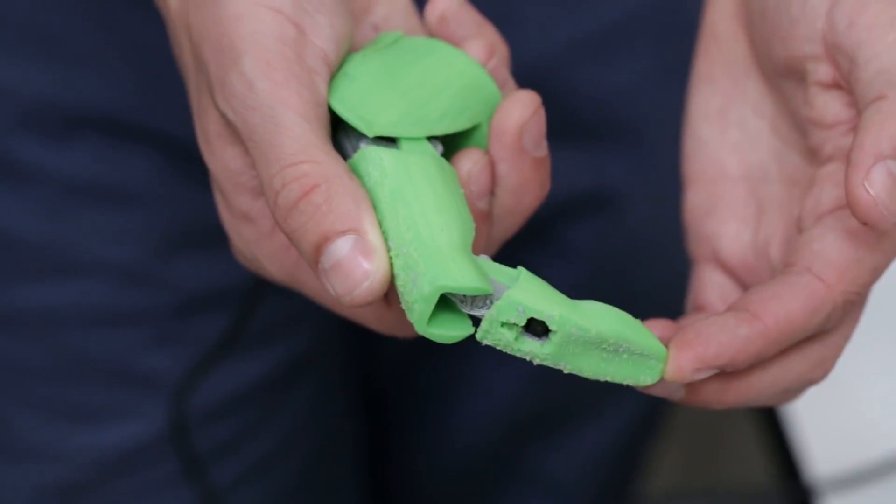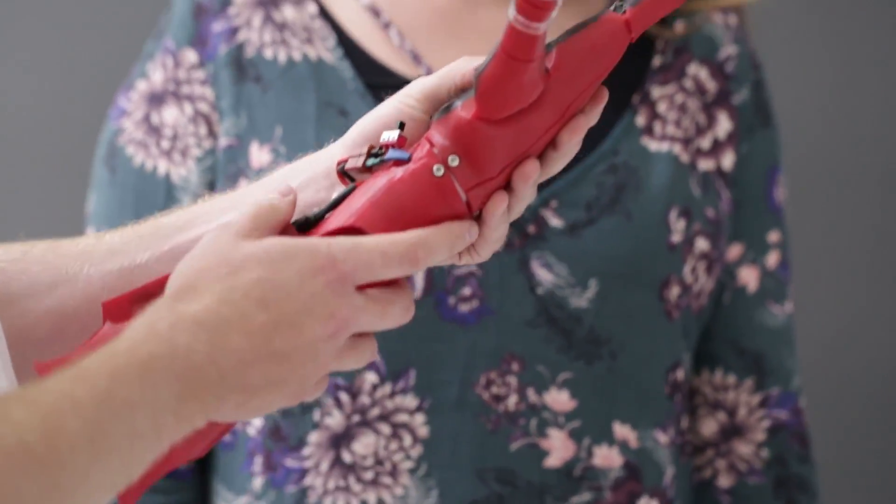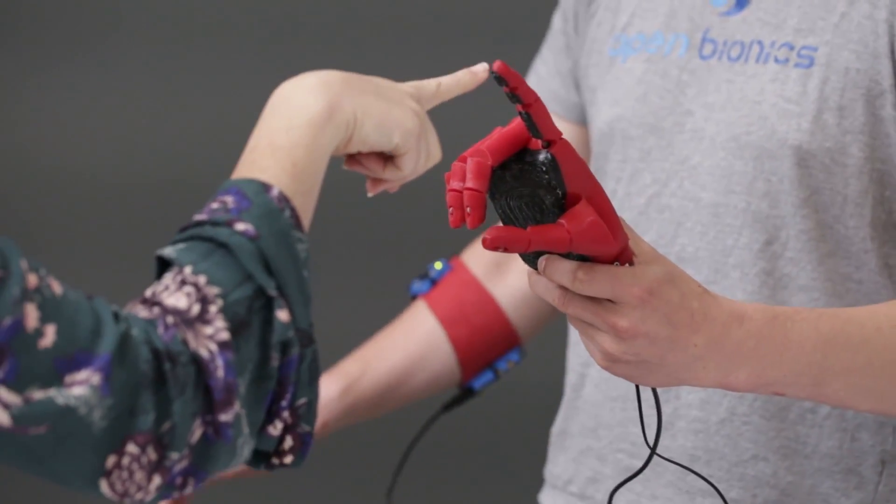Designed to be compatible for all ages, Open Bionics prosthetics are an exact match to the wearer's other hand, but can be customized in a variety of colors and patterns. This is innovative because they've reduced the cost of prosthetics by 3D printing them.